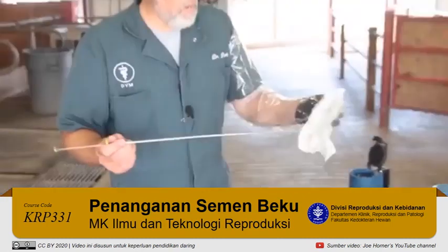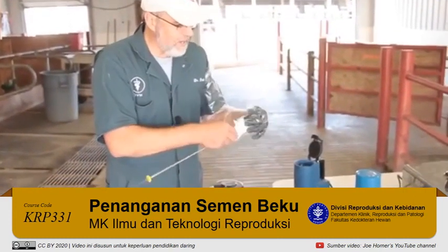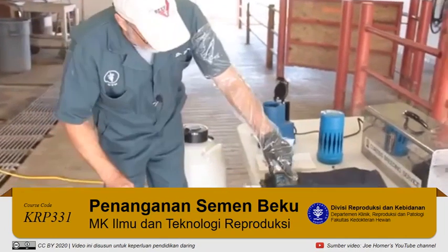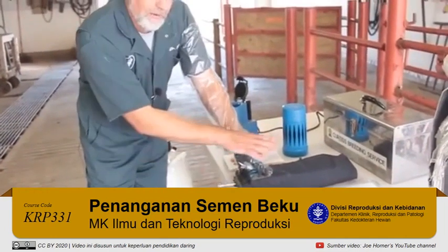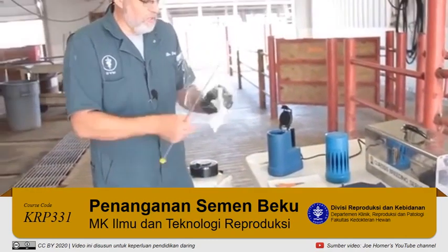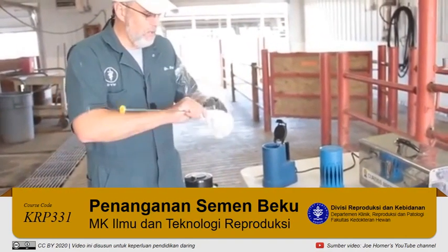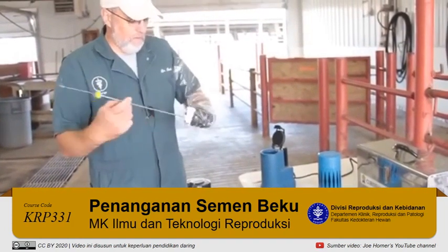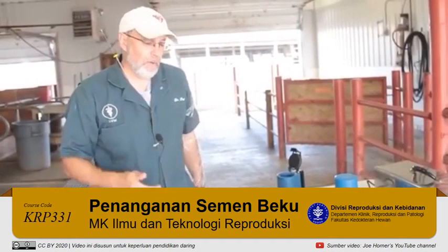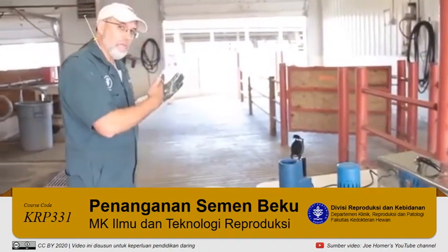Now there are one of two things I can do. If I have an AI gun warmer, I can slip it in there to keep it at 95 degrees on the way to breed the cow. If I don't have one of those, a lot of people will go ahead and wrap up the unit and put it inside their shirt to keep it warm. Either way, the goal is to keep it warm on your way to breed the cow.